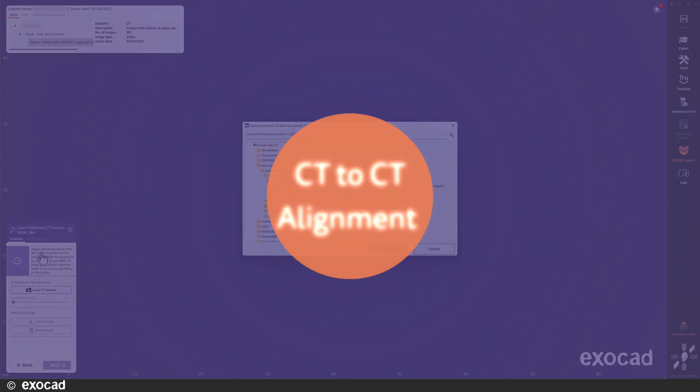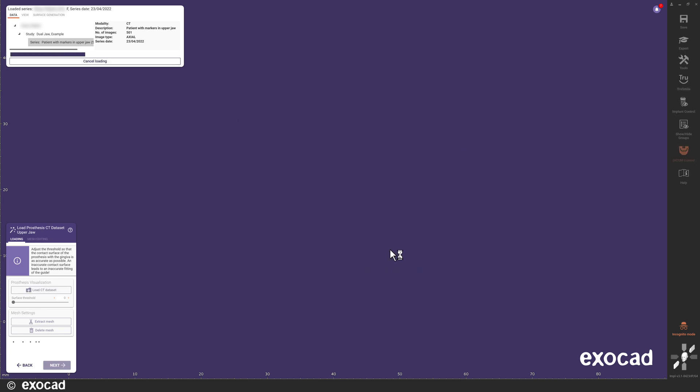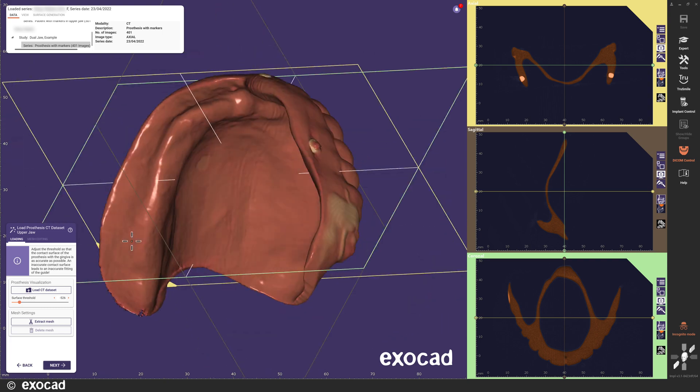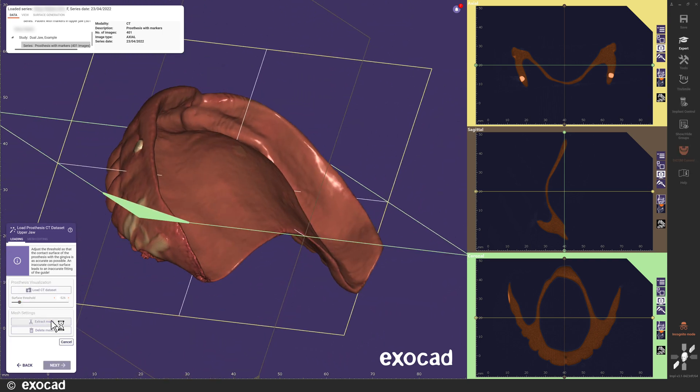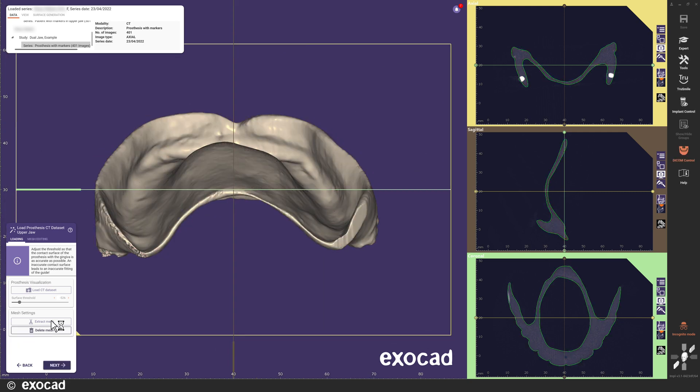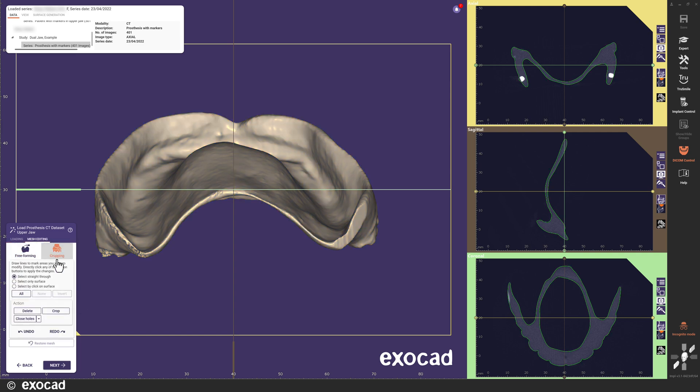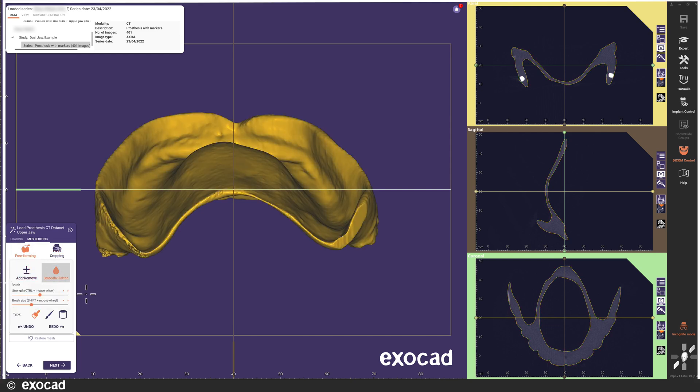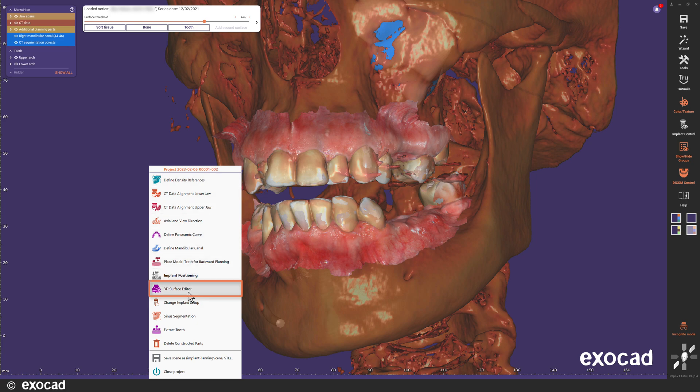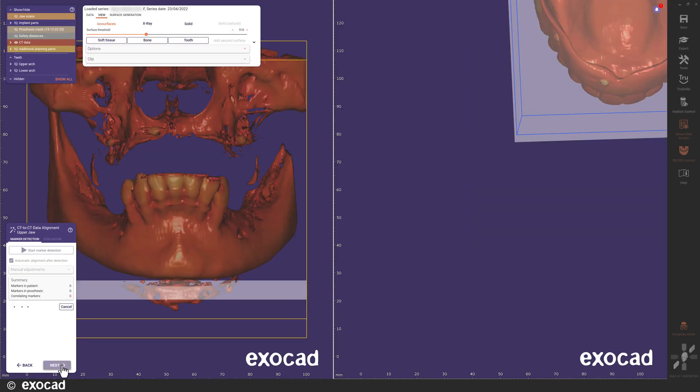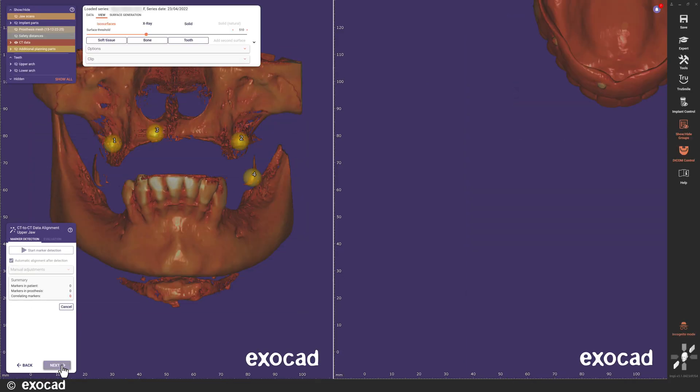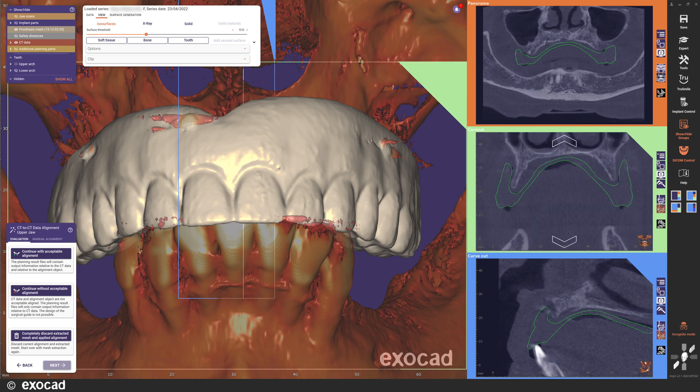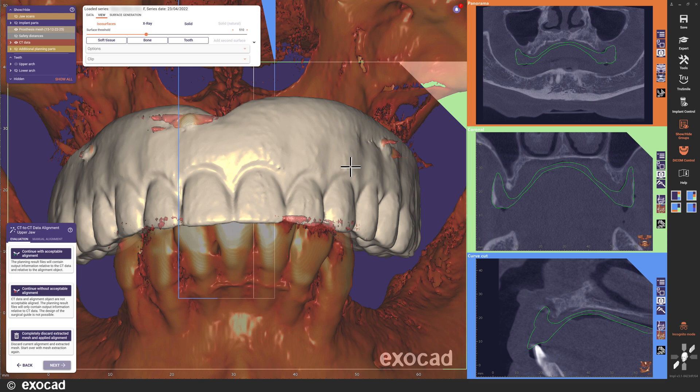Next step is to align the upper jaw and since I selected CT to CT alignment for the upper jaw, it is time to load the DICOM of the prosthesis for the upper jaw. I am selecting a threshold for the prosthesis visualization that represents what the prosthesis looks like in reality, since I want to use the generated mesh of the prosthesis later for my guide design. We have revised the look of the mesh editing to make it easier to switch between free-forming and cropping. We have also made mesh editing available as a step of its own, called 3D Surface Editor, which is available in expert mode whenever you need it. When I continue with next, the automatic alignment over the radiopaque markers in the two DICOM datasets is performed. The alignment looks perfect and I can continue with acceptable alignment.